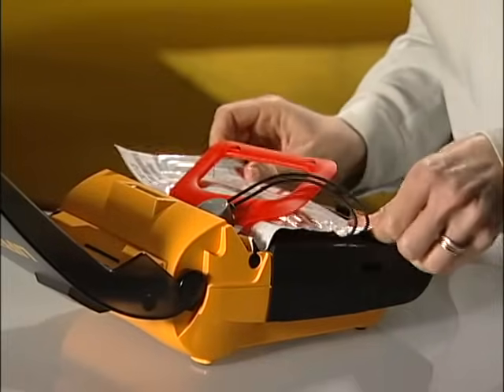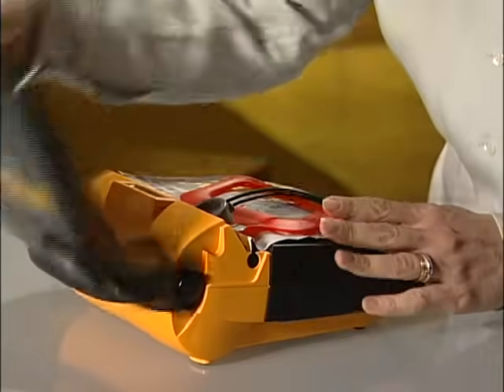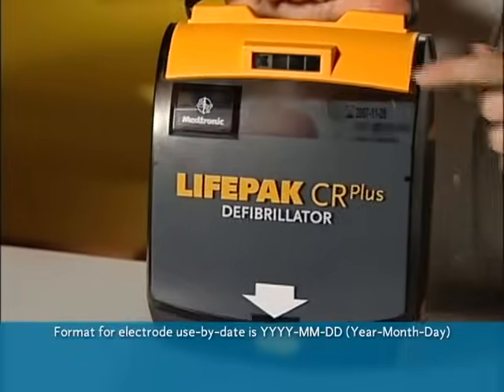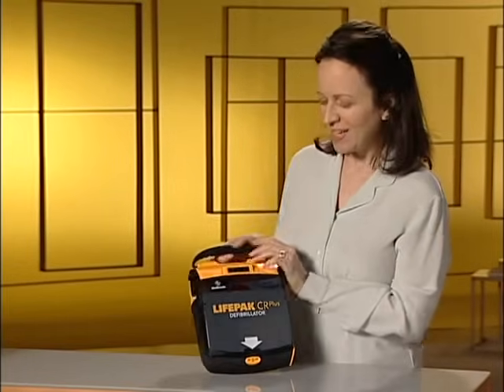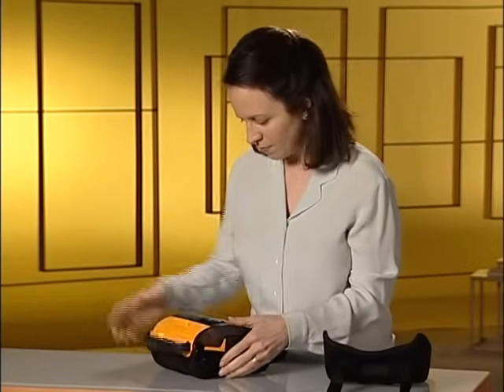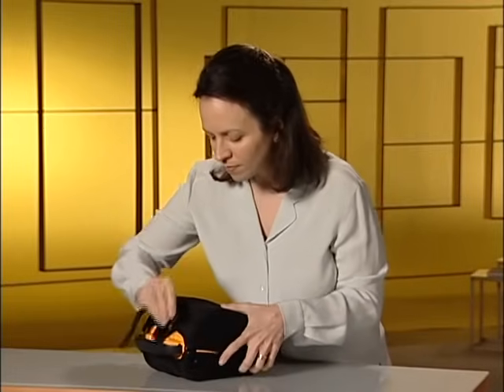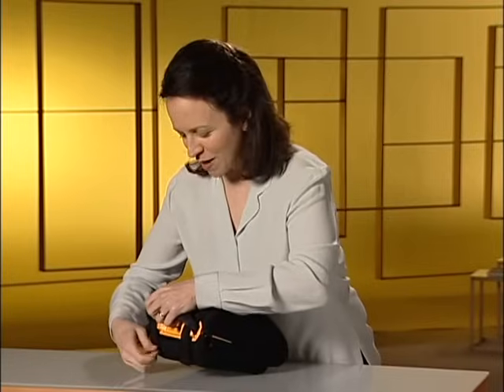Center up the package and tuck the edge under this little lip here so you can close the lid. Make sure you can see the new use-by date through this little window again. And there, all done. Some LifePak AEDs come with a soft case. Put it on like this. It closes with these Velcro straps.